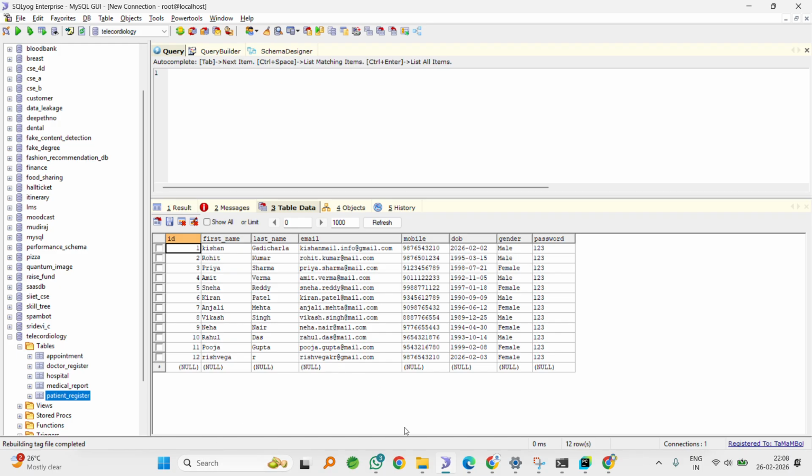Okay, if my professor asked what the storage capacity of this is, I have to say it is the capacity of my PC. Yes, currently, if you are having 512 GB, that is your capacity. For example, if you want to deploy this project into real time, you need to purchase database size according to your project. Yeah, like we have to buy some separate cloud kind of.